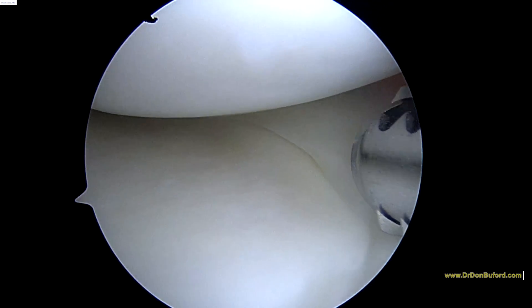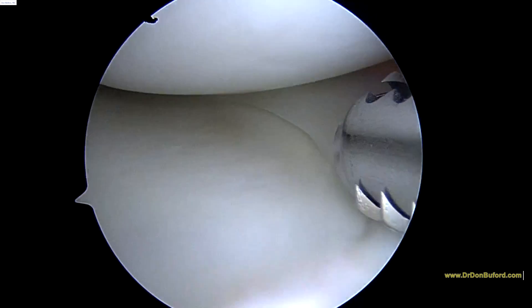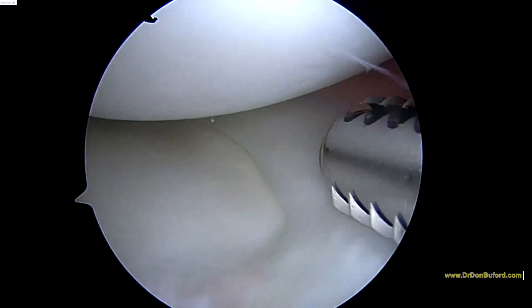Okay, hi Ash, this is Dr. Buper. Just getting started on the right knee. This is the inside of the knee, what we call the medial compartment.